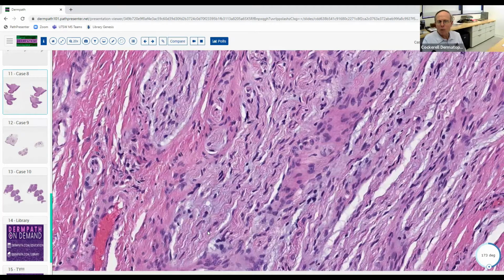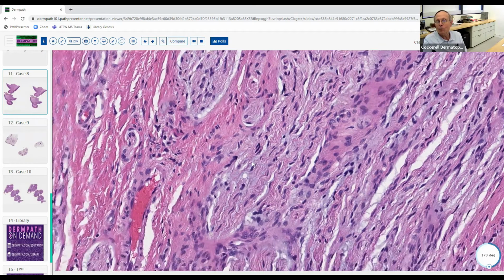It could be smooth muscle, but look at these nuclei. They're kind of nervish. I think nerve. Yeah. Notice that, if you've been down that lazy river at the Great Wolf Lodge in San Antonio, that river is like a sinusoid, a slow moving sine curve. Well, that's the way nerve cells tend to be. They tend to have this kind of lazy S shape to them. So when you see that, it favors nerve.